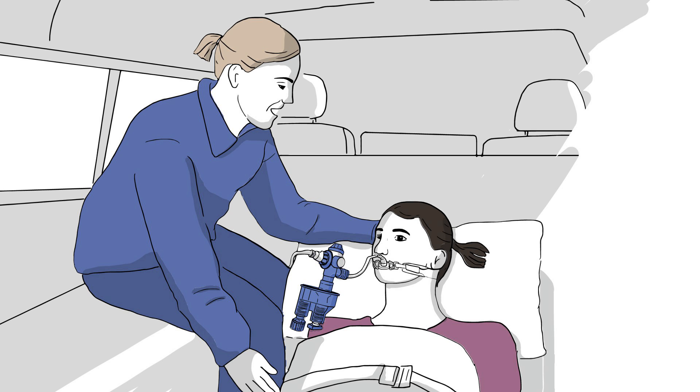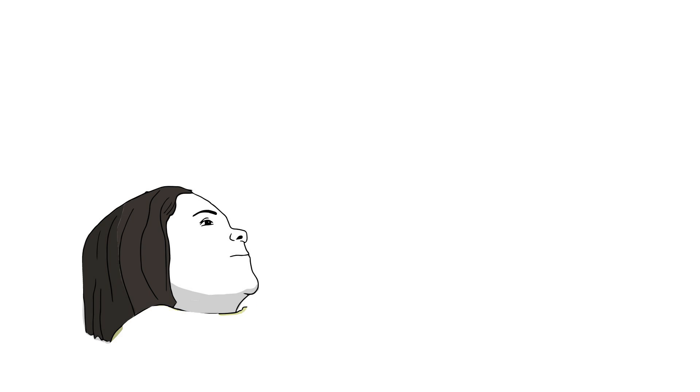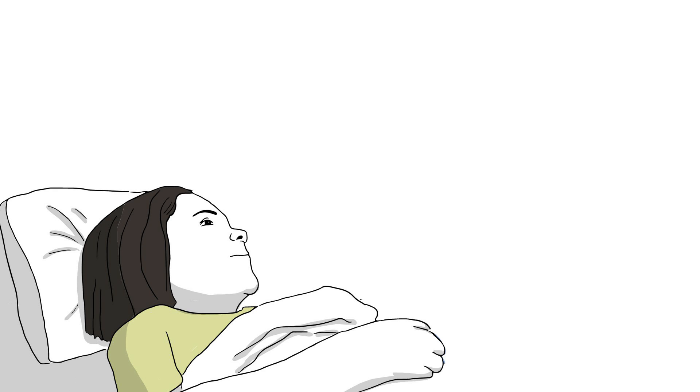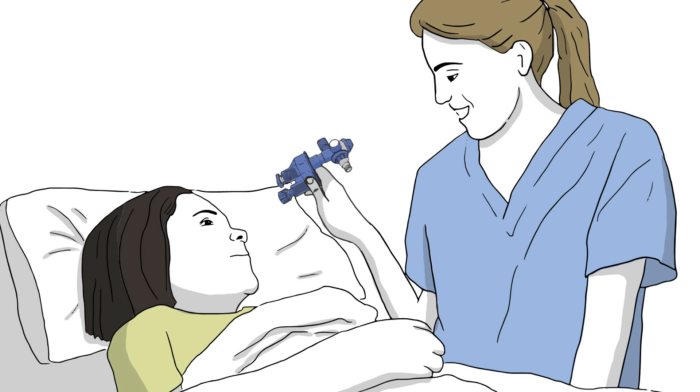The GoToVent helps control the rise of the patient's end tidal carbon dioxide levels. The GoToVent can be used on a large patient population of 22 pounds all the way up to large adults.